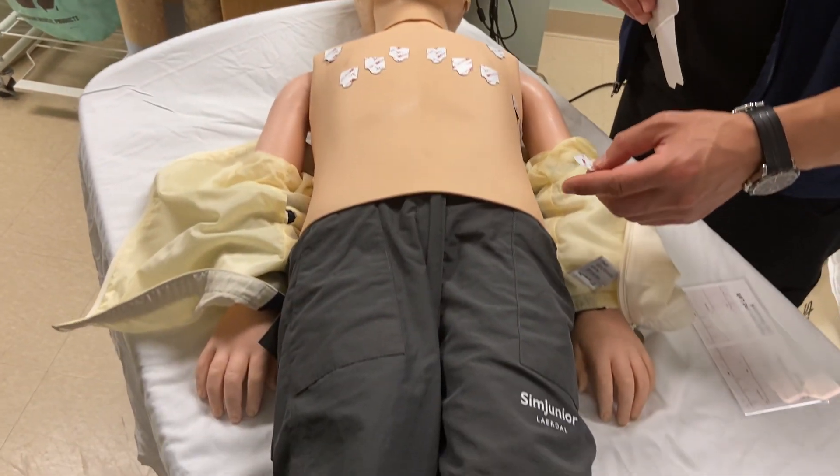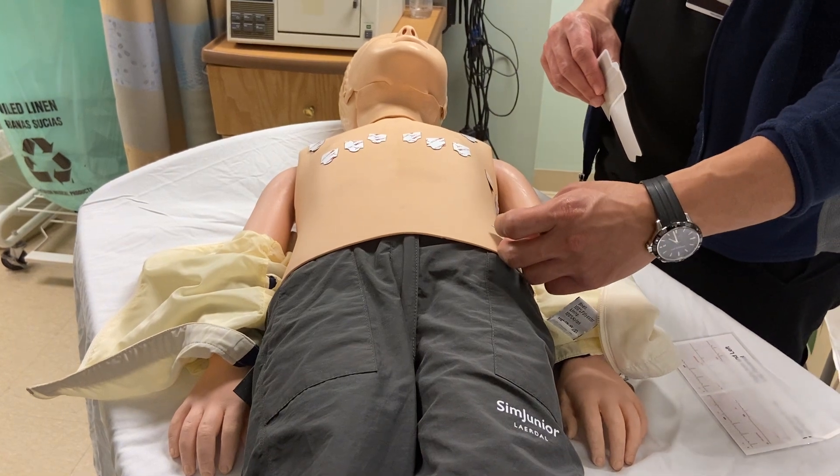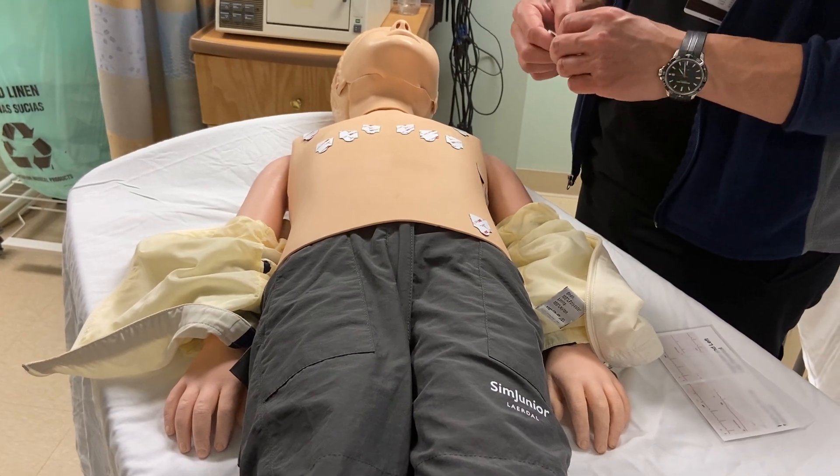Similarly for the leg leads, if they're not able to keep their legs still, you can place them in the lower abdomen or pelvic area — on the left side for the left leg, and on the right side for the right leg.